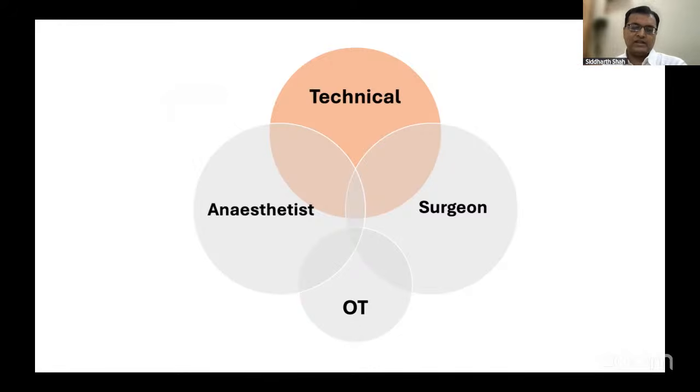So the usual workflow is that we do a baseline reading with the patient supine. We do one with the patient prone. If you're going to apply halofemoral traction, then we do one after traction goes on in prone. Then we do one before we start the exposure, one before we start putting the first metalwork in, and then a trigger MEP is done at every pedicle screw. That helps us stratify and document where the issue happened, because picking up the issue is one thing, but picking it up at the right time is going to make a lot of difference to how much of it you can correct and reverse. So doing these small things does help.